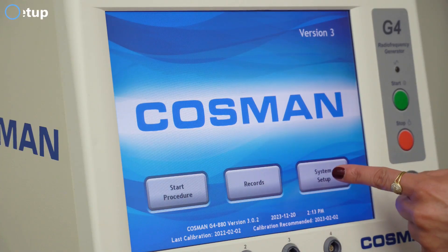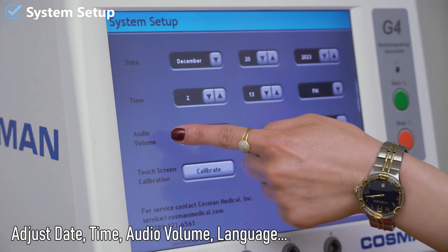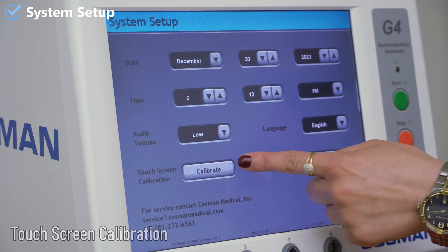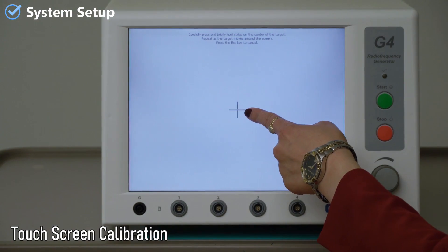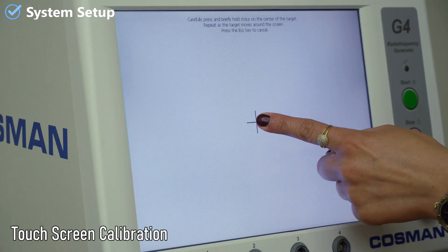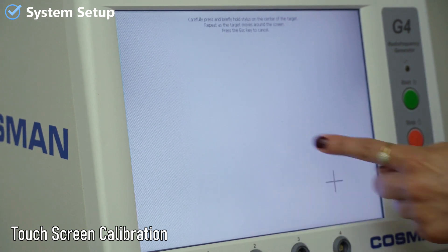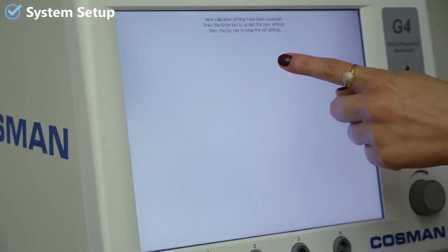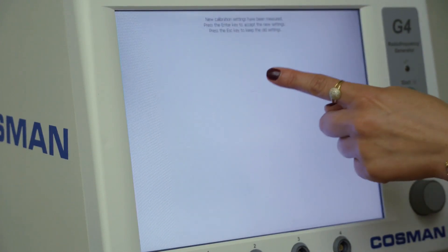On the main screen, there is the system setup where we can set the date and time, adjust audio volume, change language, and perform touchscreen calibration. To calibrate the touchscreen, just press and briefly hold the center of each cross-shaped target, then release your finger and repeat the process when the target moves. When the cross symbol disappears, press anywhere on the screen to return to the system setup.